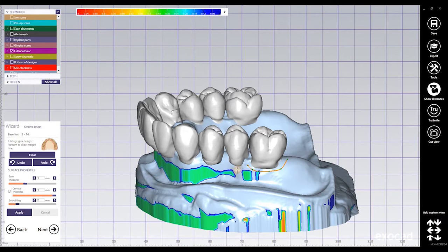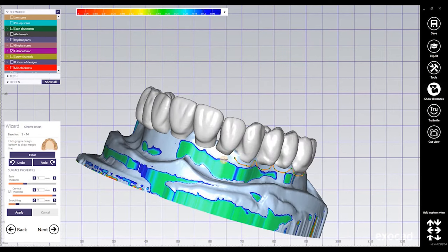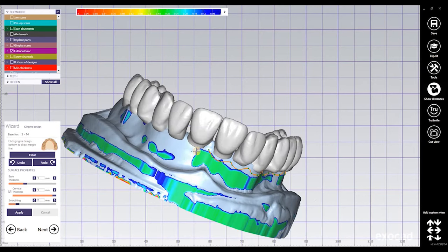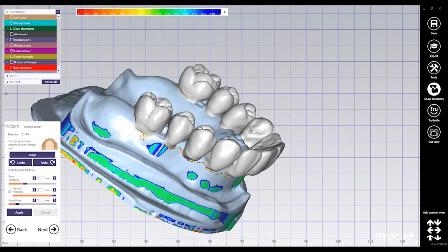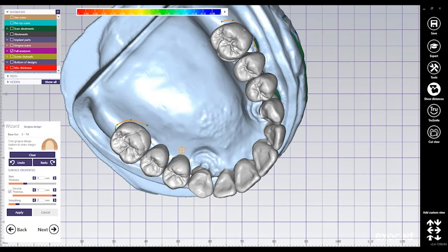where you want to have the end of the line of your gingiva. You can go into proximal to create a more realistic result later on. Usually they go really close to the teeth. If you haven't cleaned up the necks of the teeth in the previous step, you might get some distortion and the tissue gets extended over these areas.